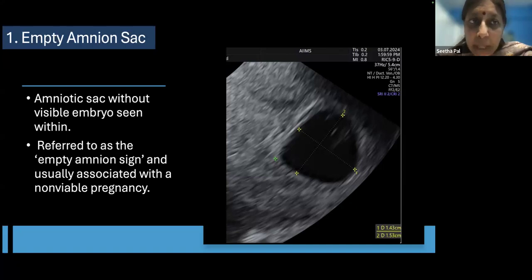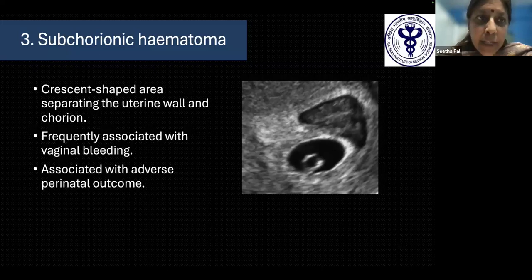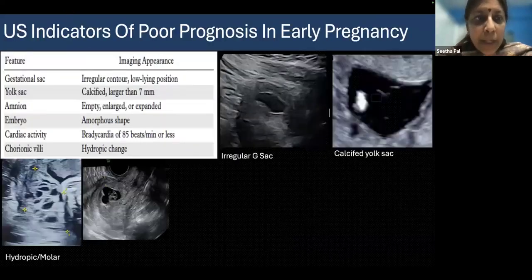Or if there are signs of bleeding, a subchorionic bleed, that could be there. But most of the time, if it's not more than 50%, the pregnancy would go on. So these are all telltale signs where we could follow them up. They are not definitive of diagnosis, they're only suggestive, but all the definitions would be based on the measurements, as you've put about 7 and 25.